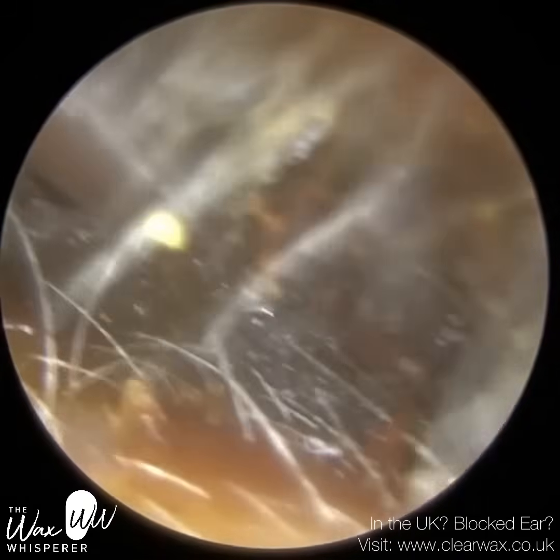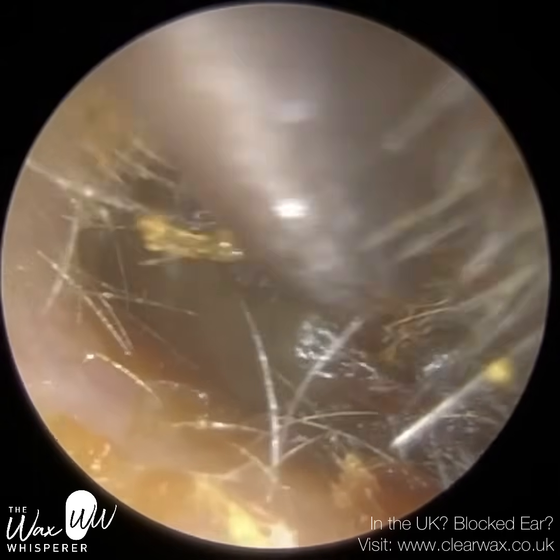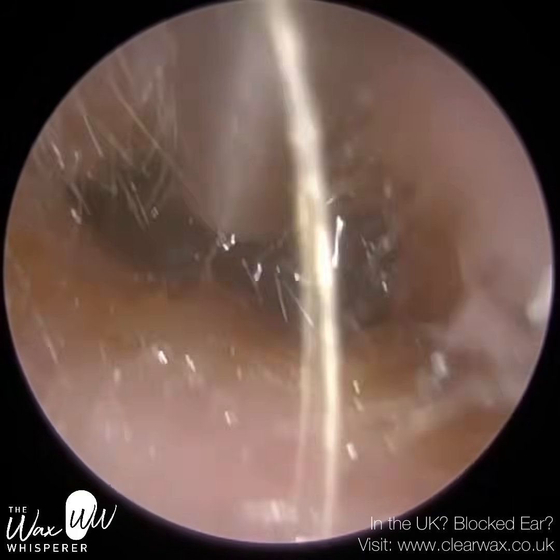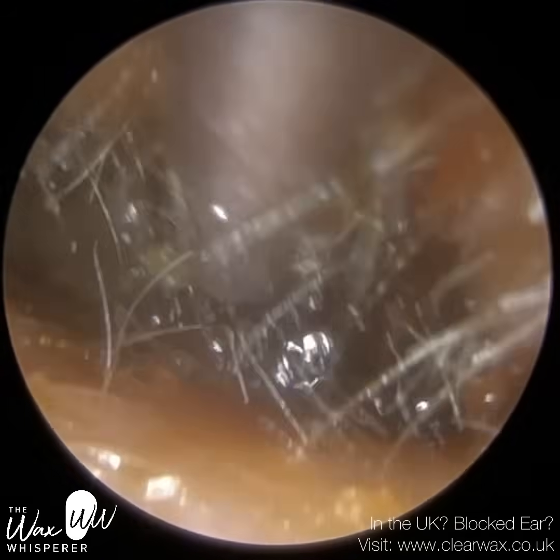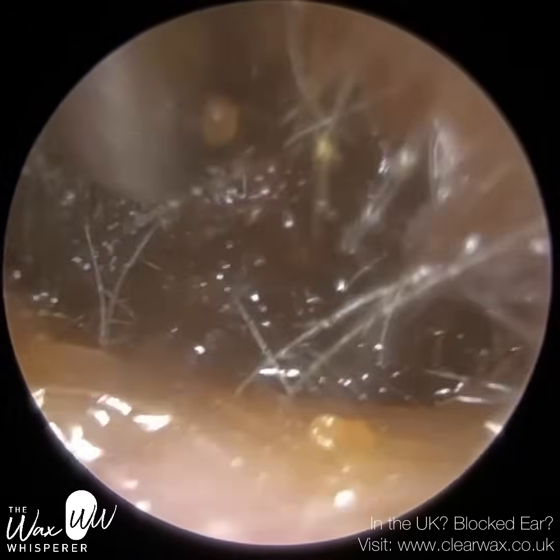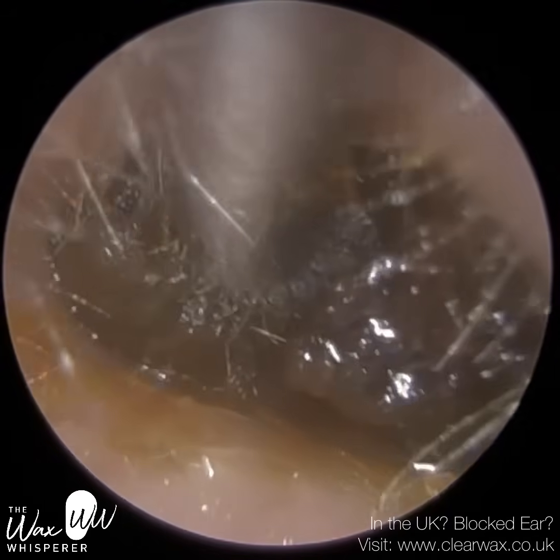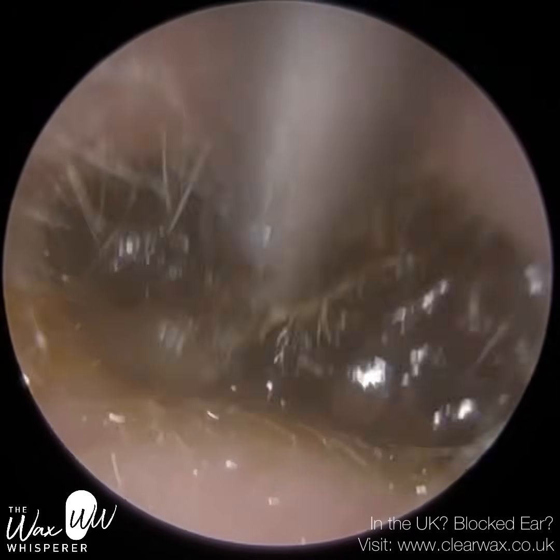If you watch till the end, you'll see a still image of the wax plugs from both ears, and I was able to remove the plugs in their entirety. I've just instilled some olive oil ear spray — medical-grade spray. What this does is it just binds the wax together and makes it a bit easier to remove. The oil also helps to prevent blockages inside the suction probes as the wax is travelling up the sucker — it's less likely to block and congeal inside because the oil will help to lubricate it.